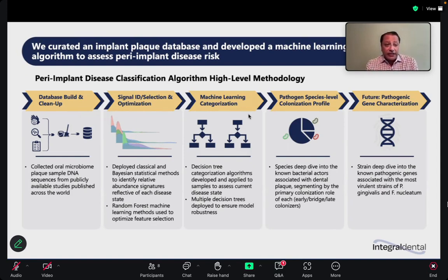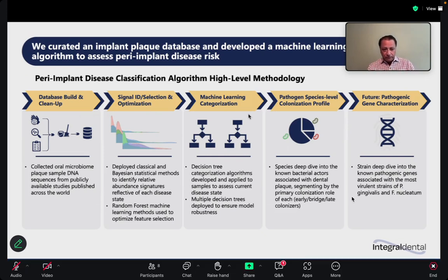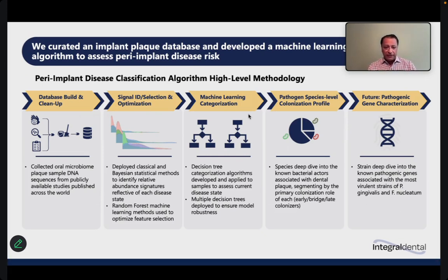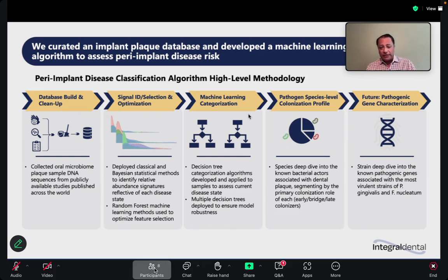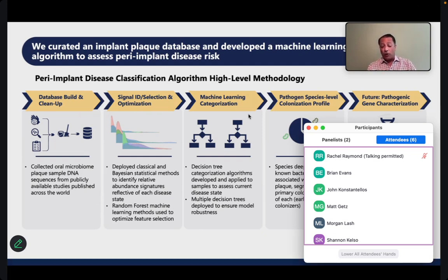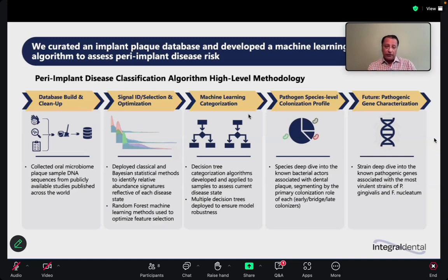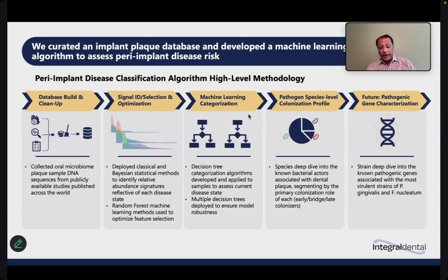Now, what's really interesting about the test, Oracle, is its history and what it can offer us. So they've basically collected the DNA plaque samples from several worldwide studies. And of course, we found there's the usual suspects. Then they used machine learning to deep dive into the patterns on the progression of disease associated with each bacteria or family of bacteria. So based upon that information, a decision tree of treatment algorithms was developed so that multiple stages of diseases can be managed.